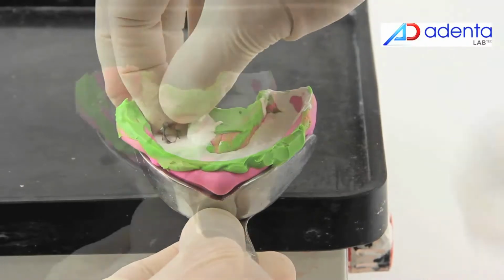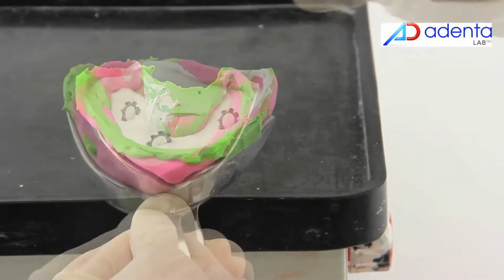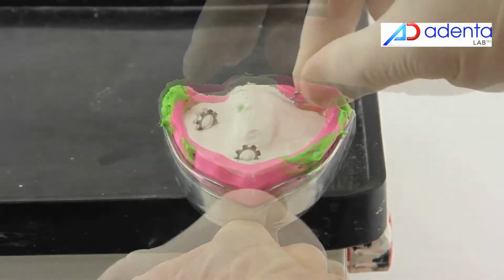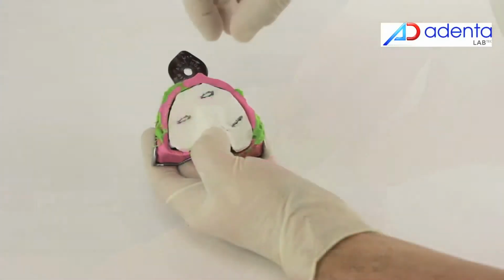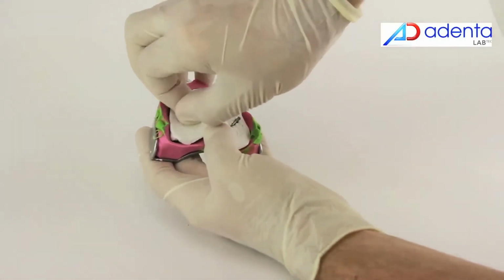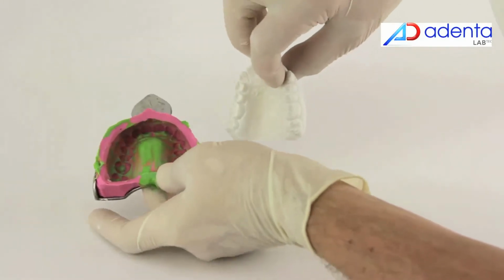Before the plaster is completely hardened, the stainless steel rings should be positioned in order to make the removal of the model easier. As only the dental alveolar zone is poured, grinding is not necessary to start the study model's procedure.